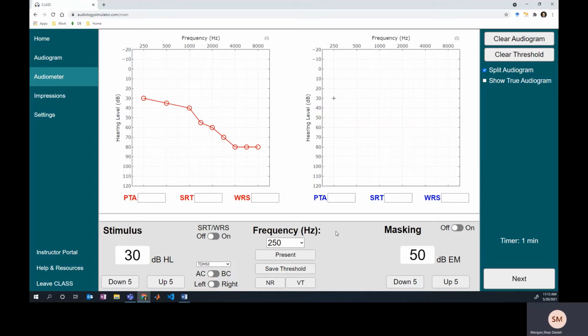We're done with the right ear air conduction. I think we did all the interoctaves that we were supposed to, so we're good to go there. Let's do the left ear, and I'm going to assume that it's somewhat symmetrical, and that'll probably bite me here, but yeah, there we go. We're going to get this super non-symmetrical hearing loss. I picked my starting level assuming that there might be a symmetry, and so I guess that proved me wrong.